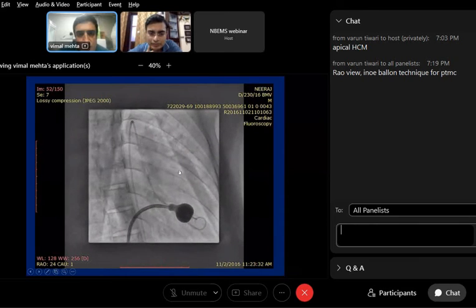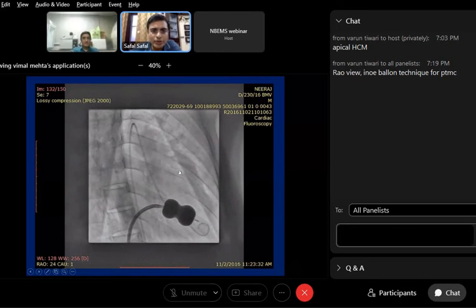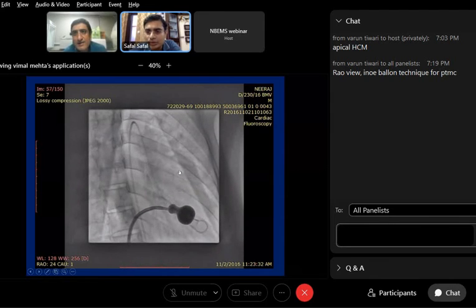And tell me the catheters. INOUE practically was the only one that was used till some time ago. But now on fluoroscopy, you really cannot make out the difference between the INOUE and some of these Made in India catheters, including Accura, etc. So suffice to say, a BMV balloon. Yeah, now come to this part. Somebody has answered going from RA to LA through septal puncture. So according to you, we are doing an atrial septostomy over here, RA to LA, and then dilating the balloon.